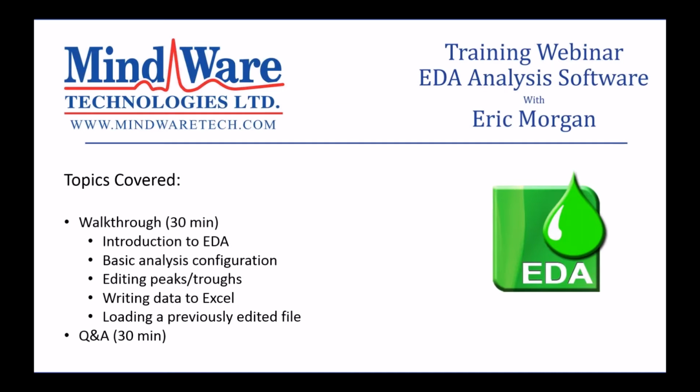The webinar is going to be broken up into two main components, a walkthrough and a question and answer session, each of which will last around 30 minutes. Throughout the walkthrough, we're going to talk a little bit about what EDA is, what it is we're measuring, and what we're looking for when we analyze EDA. We're then going to open up the EDA analysis application, and we're going to go through some of the basic configuration steps involved in looking at EDA.